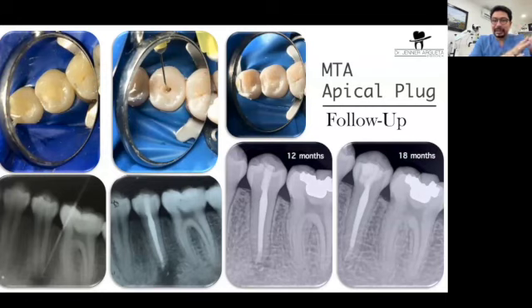We will start with that. The microscope is a tool for you guys. If you are a dentist, you are going to buy the microscope because of you. And then you are going to provide all the benefits and transmit all those benefits to the patient, because it will enhance your ergonomics. It will provide you a clinical environment in which you will be relaxed.